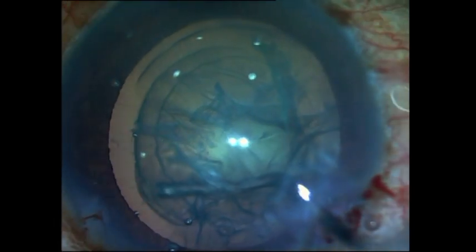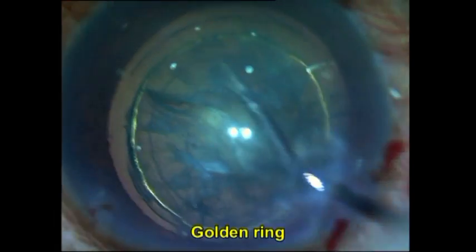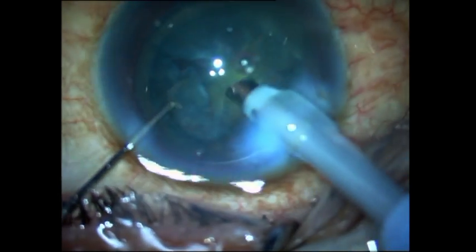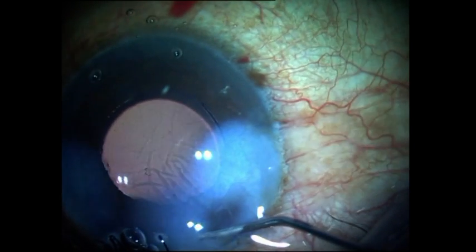A hydro delineation is being performed here. Note that hydro dissection was not performed — that is a contraindicated step in posterior polar cataracts. Hydro delineation is performed until I get the golden ring, which tells me that the nucleus has loosened up. Then you can go ahead and lollipop it out of the epinucleus shell, and the rest of the principles are the same as explained in the previous case.